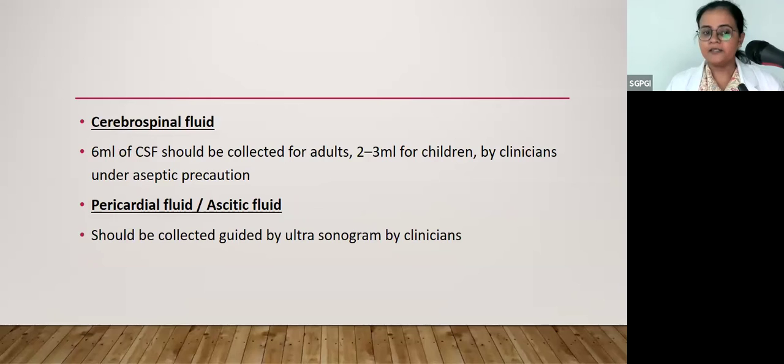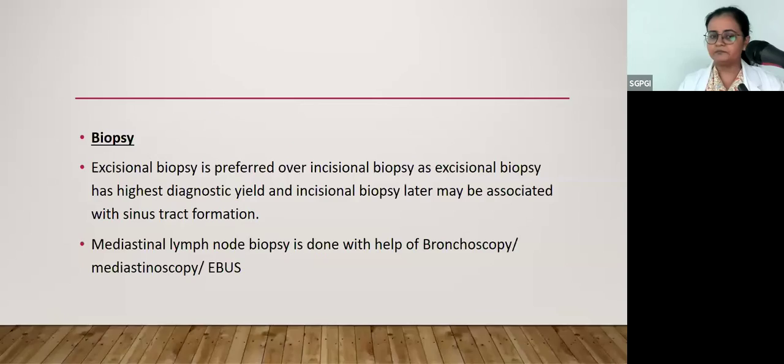Cerebrospinal fluid, that is CSF, 6 ml of CSF should be collected for the adult and 2 to 3 ml of CSF for the children by the clinician under aseptic conditions. Pericardial fluid or ascitic fluid should be collected guided by the ultrasonogram by the clinicians.